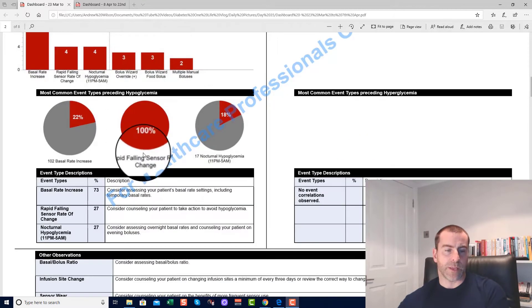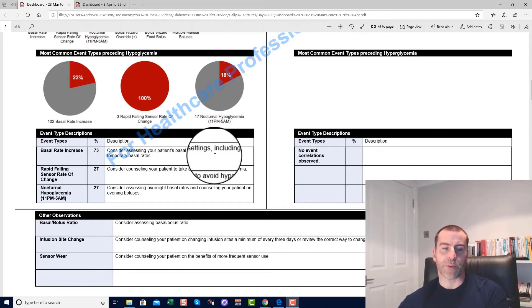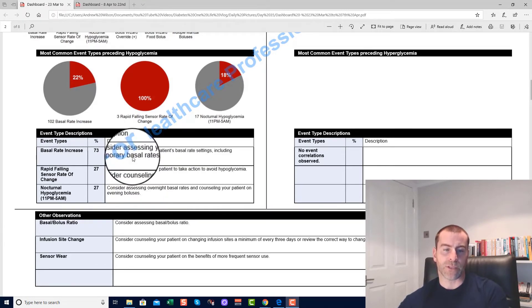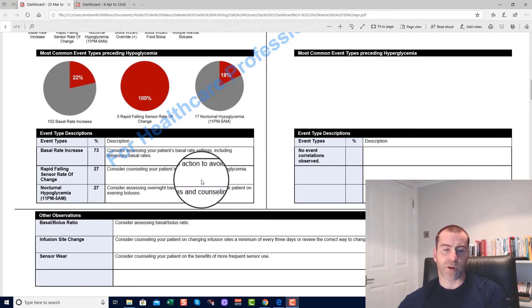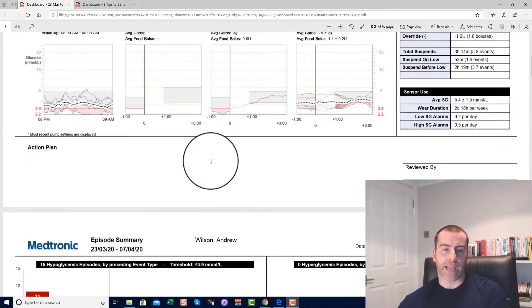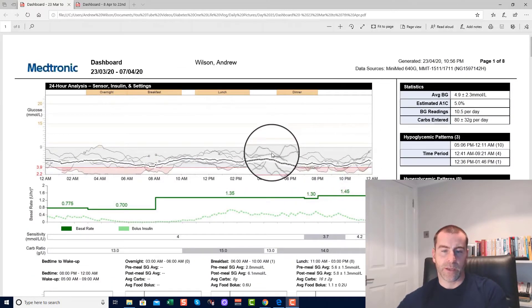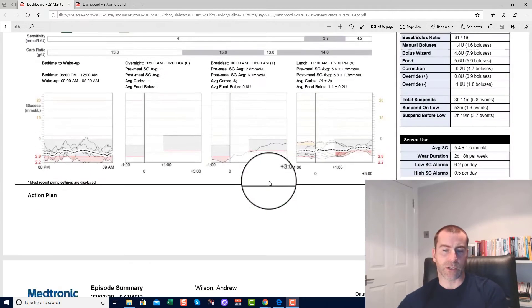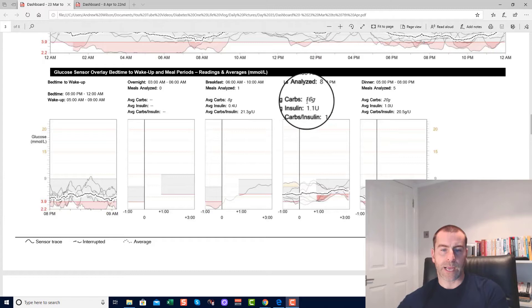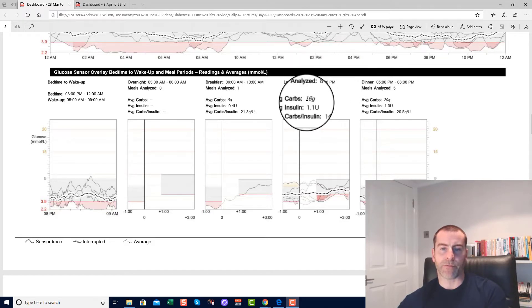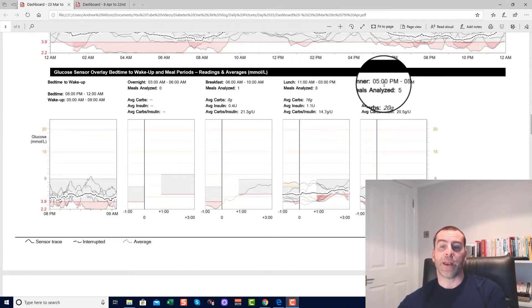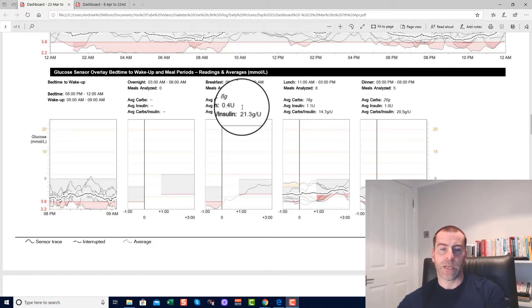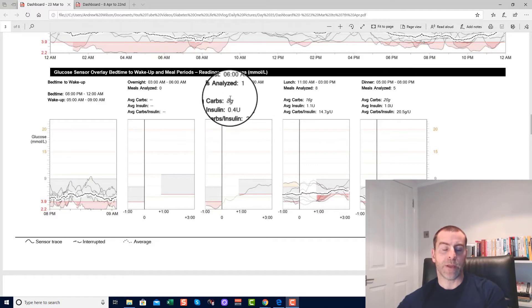The advice that they give here is consider assessing your patient's basal rate settings, consider assessing overnight basal rates. Well, we've assessed the overnight basal rates. Now what we were looking at was the basal rates at this time of day, between sort of 2, 3, 4, 5, or 6 o'clock at night. A couple of things stand out: average carb intake between 11 and 3 PM is 16 grams, and average carb intake between 5 and 8 PM was 20 grams. Now bear in mind we've got 8 grams here between 6 and 10 AM—that's clearly two jelly babies.